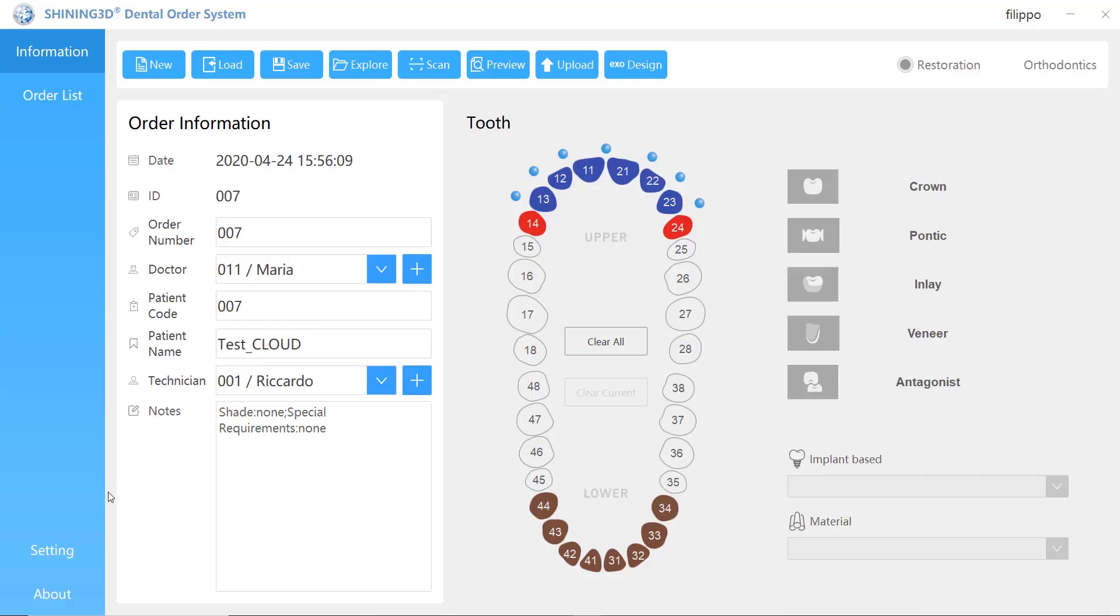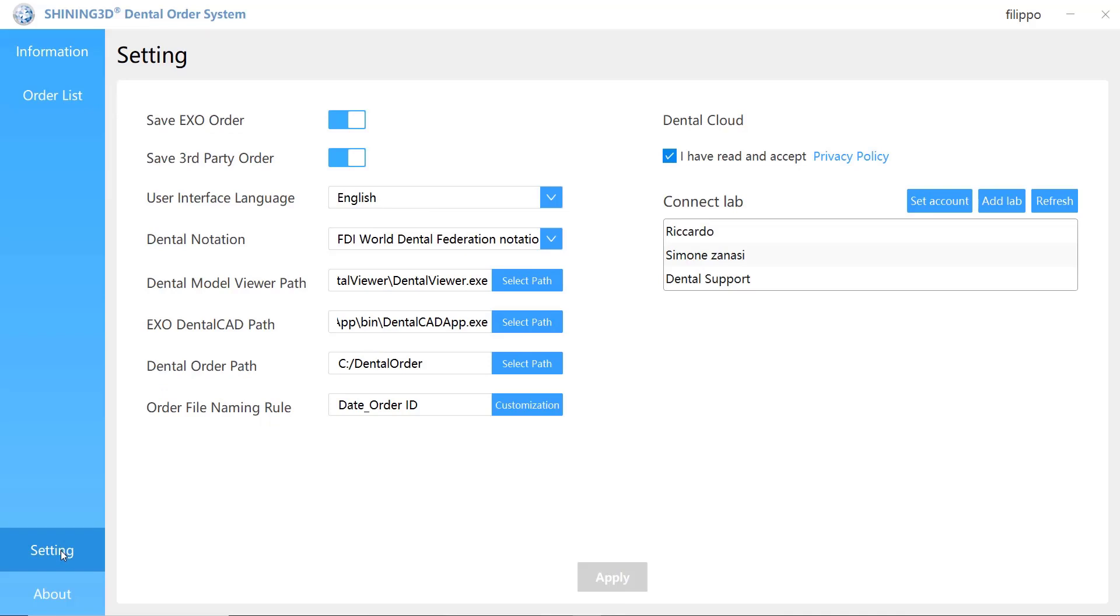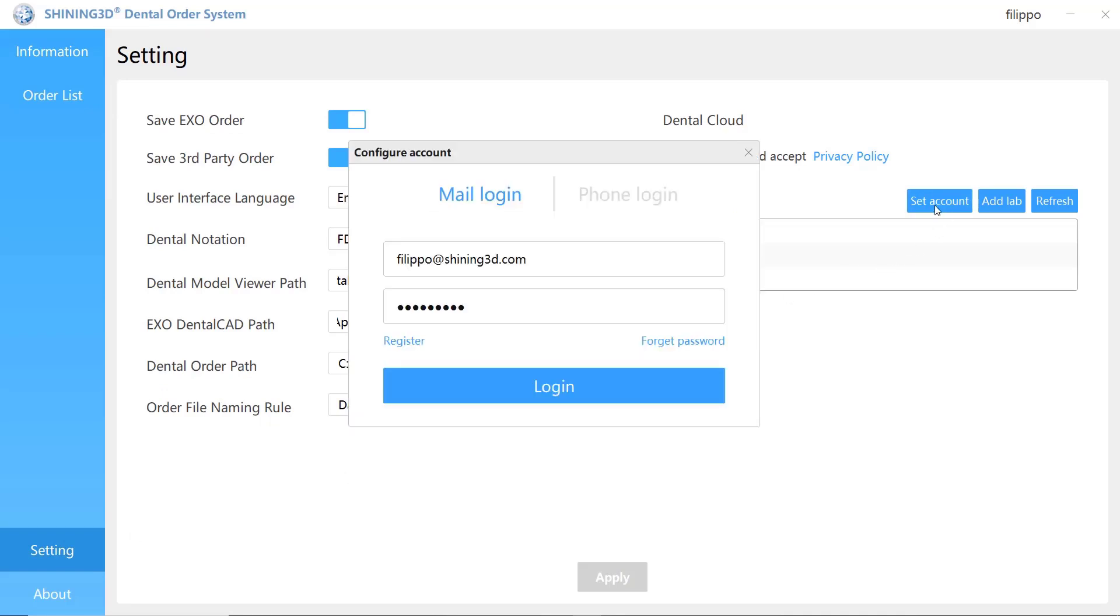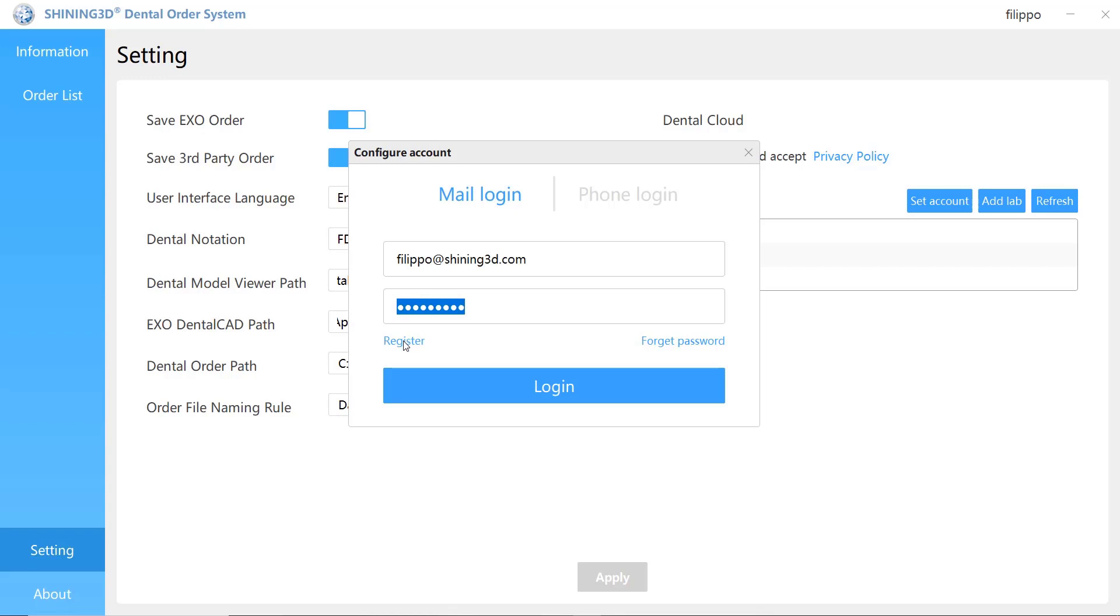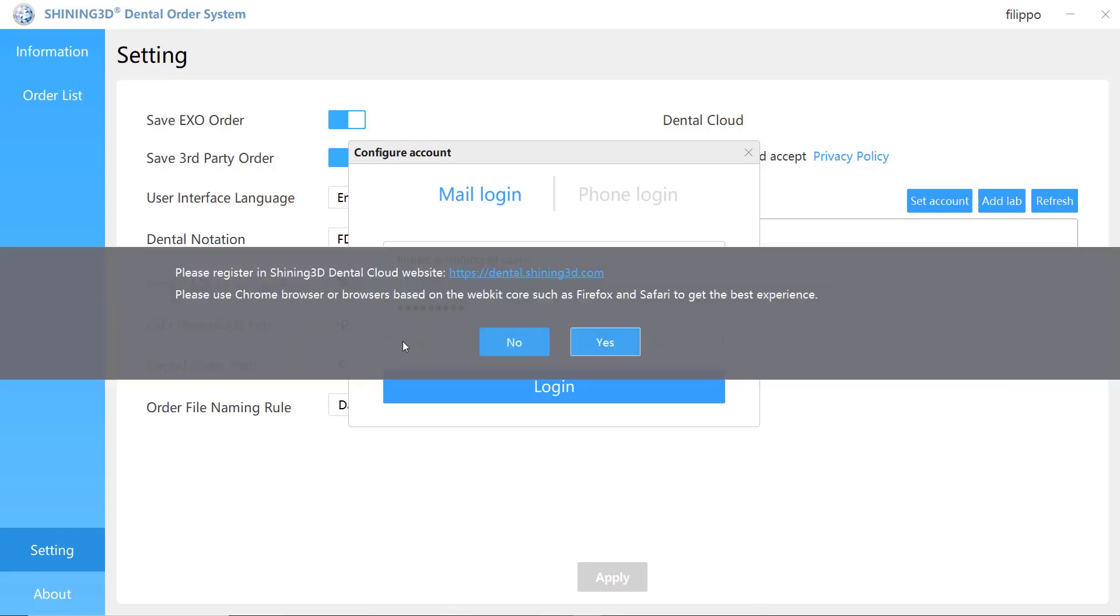The last important thing is once complete the registration in the dental cloud website, it's necessary to connect your account in the dental order system. Clicking on set account, it's necessary to insert your email and your password and press login.